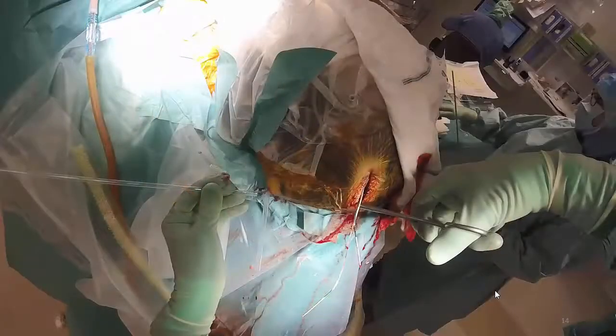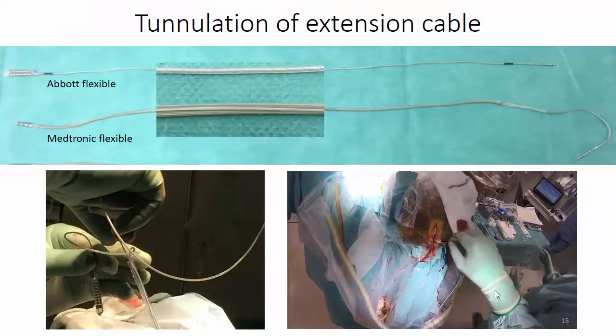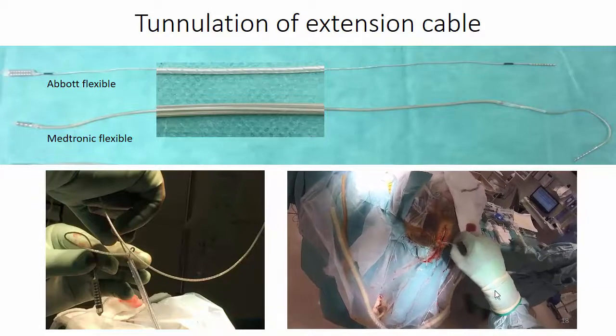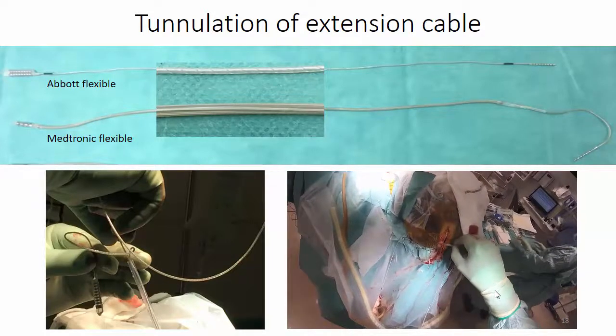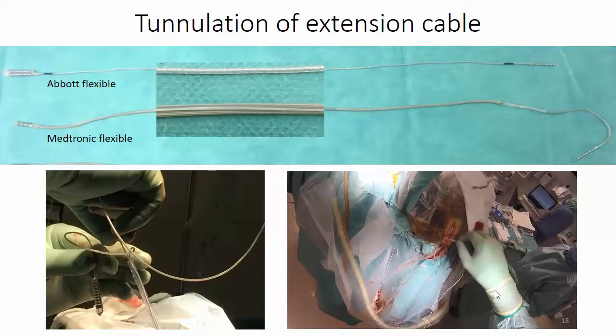The tunnelation between the cranial incision and the incision behind the ear can be made with the tunnelation tool, but often it is faster to just pull up the plastic tube using a large clamp. The Abbott extension cable is very thin and is tunnelated from the cranial incision to the IPG incision, which is the opposite direction to the tunnelation of the Medtronic extension cable.